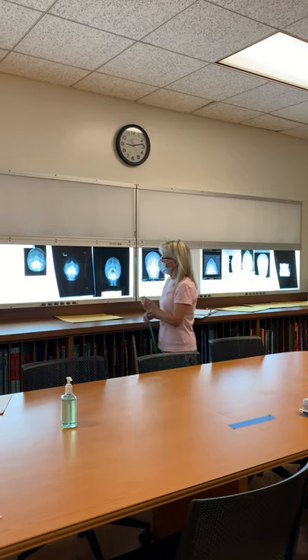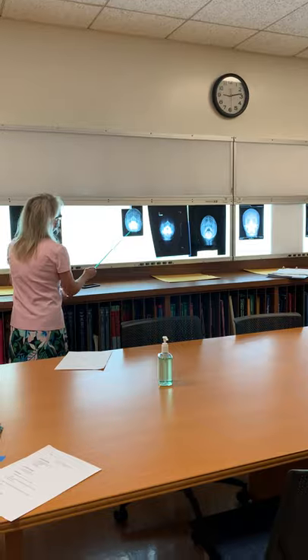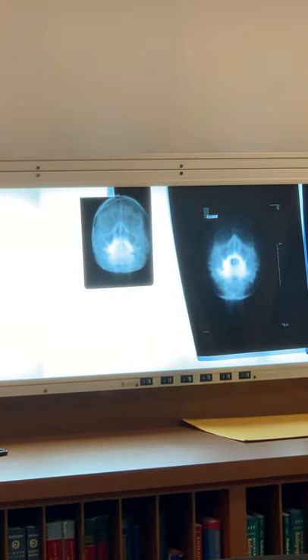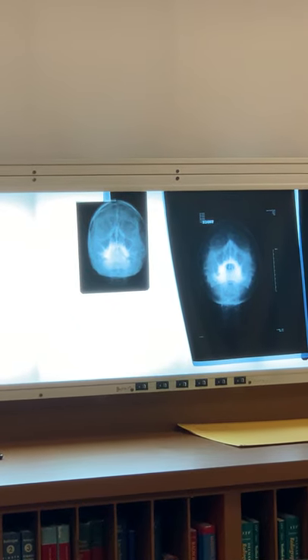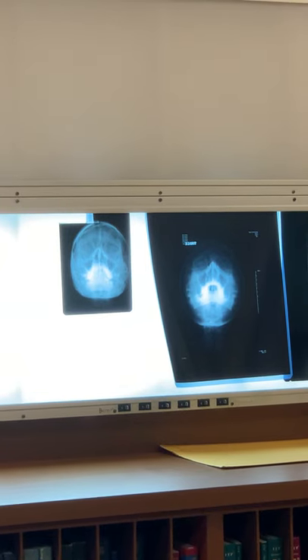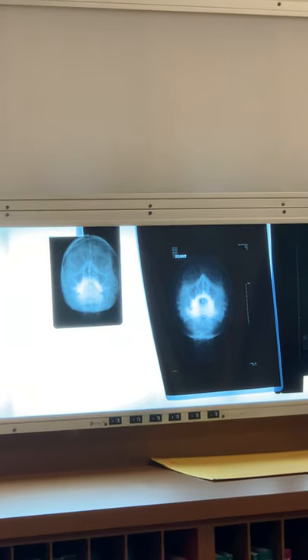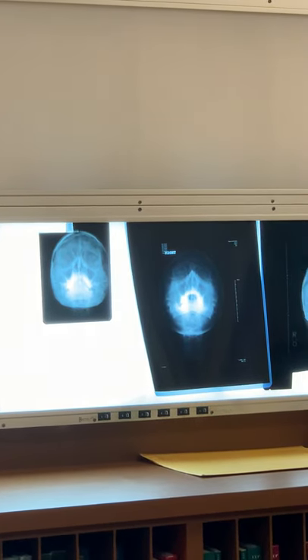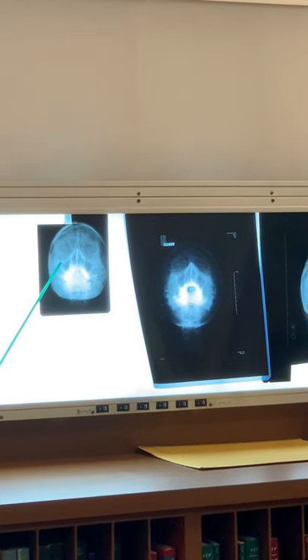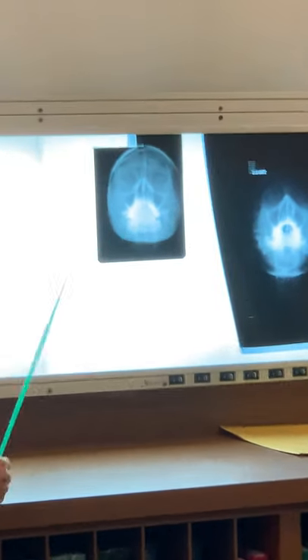Okay, so here's some Waters hanging up here. Let's talk about correct baseline beam relationship first of all with this one. What should we see if we use the criteria? Petrous ridges should be where? Below the maxillary sinuses. Good. They should be just below the maxillary sinuses. So the maxillary sinuses are triangular in shape, and here they are. Here's one here. So what would you do?